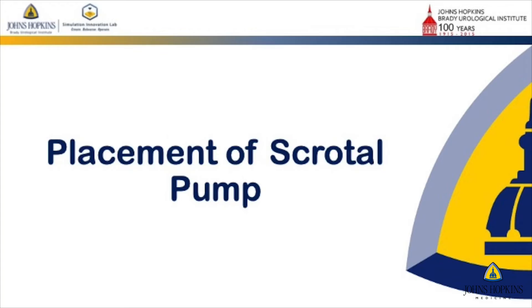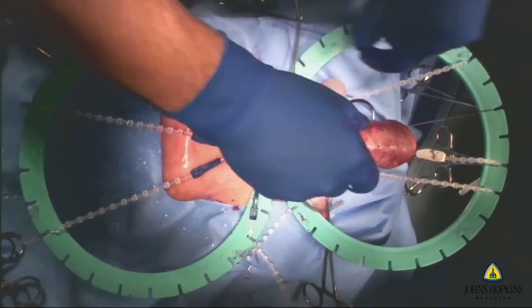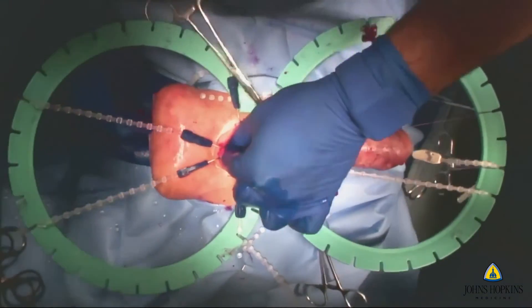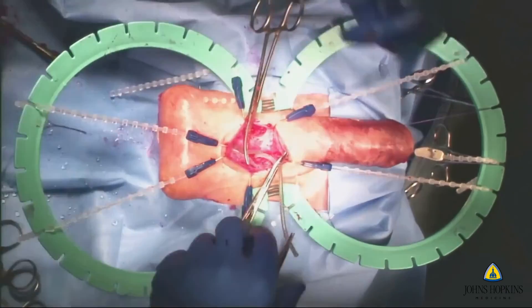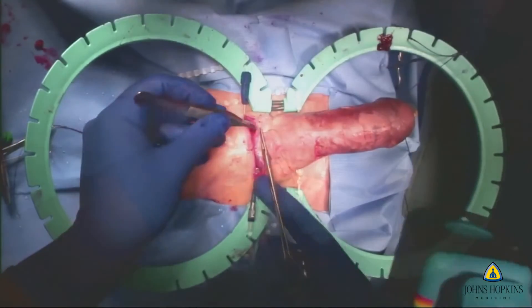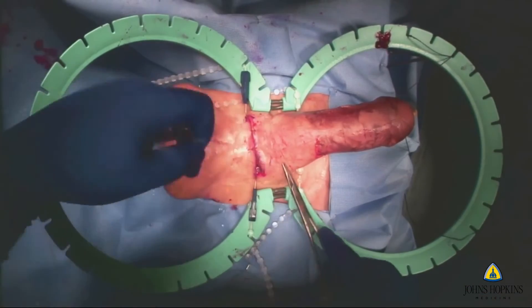They're now placing the scrotal pump. A lot of research was taken into really finding the adequate plane and the adequate tissue that would serve as that soft, fiber-fatty, elastic tissue of the scrotum that you can actually place the pump in. Finally, trimming of the implant and tubing as you normally would do — this is a very important exercise — and then closure of the skin at the end to make sure the skin is closed adequately.